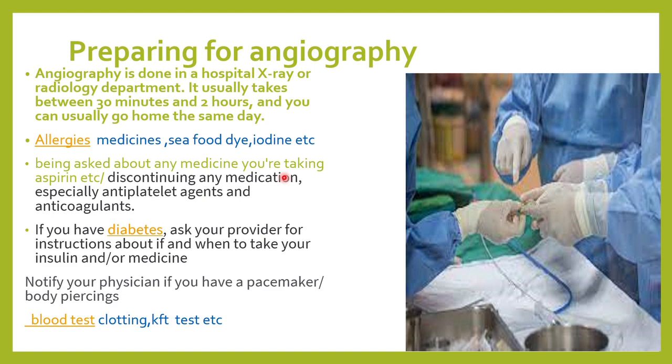In today's class, let us briefly understand how we exactly do this angiography. So I have told you angio is blood vessel, graphy is the study of this blood vessel with the help of an X-ray. So in angiography, we are studying the blood vessels. It could be blood vessels of your heart, kidney, lungs, or liver. It could be anything. The study of blood vessels is called an angiogram.